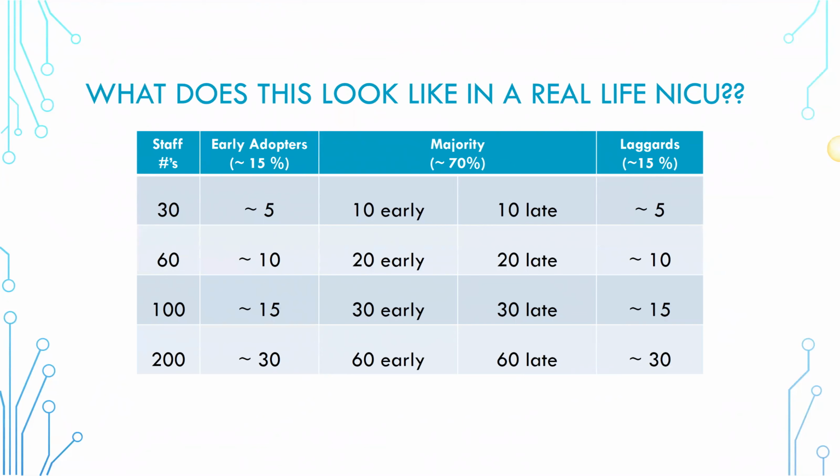So when we think about recognition and teaching recognition, we want to be sure that we are thinking about what are the most important, the key things that we want to be looking at. And so we've got pattern recognition, where we focus mostly on the normals, or what I like to say, the expected patterns for age. We also want to make sure everyone is aware of what suspicious patterns are, so that those are taken care of in a rapid fashion. And then we want to focus on symmetry if you have more than one channel, which most of our devices do now. And then you want to think about your criteria for notification.